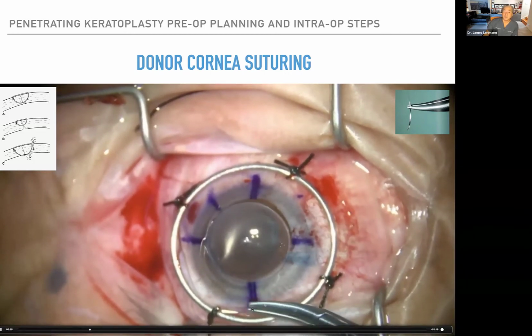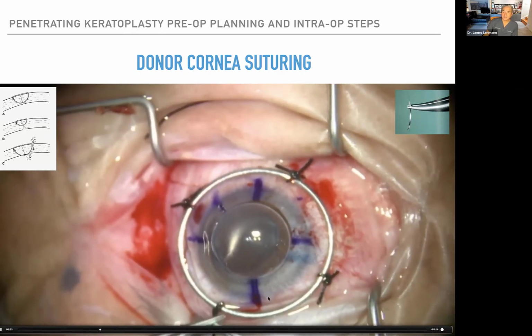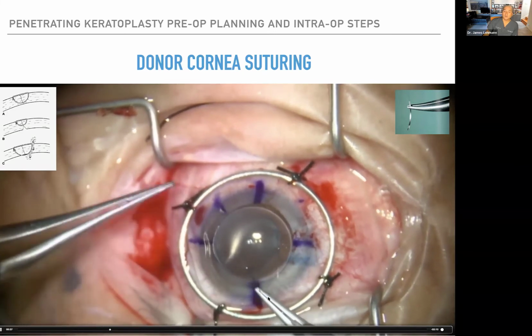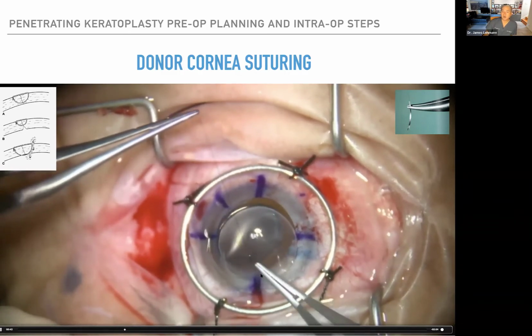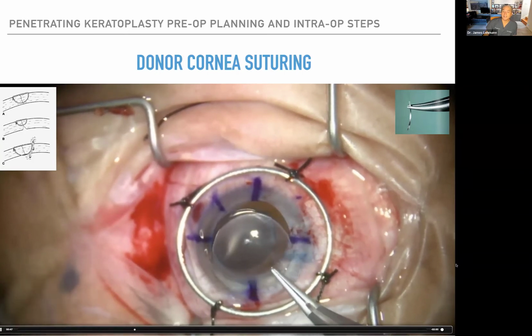And then notice how I pull that needle through. I didn't just yank it in one go. That distorts, that'll bend the needle, or it will dull the tip. You have to kind of bring it out gingerly. And then you do a 3-1-1 surgeon's knot, and you always lock it back onto the cornea, okay? So that was 3, and then 1, 1.